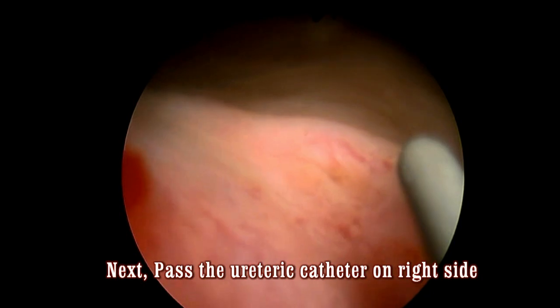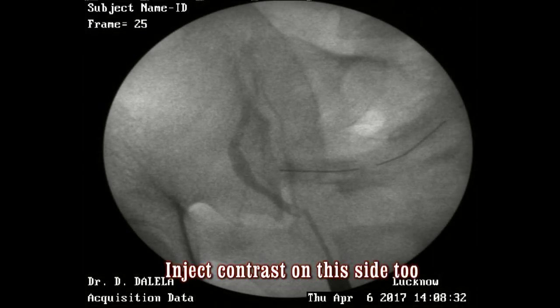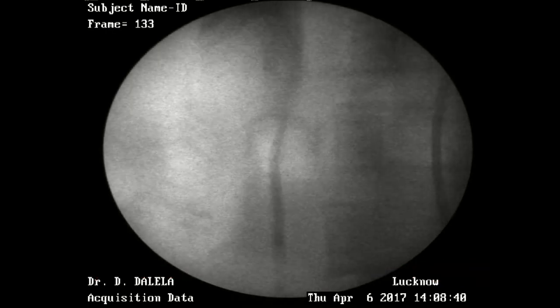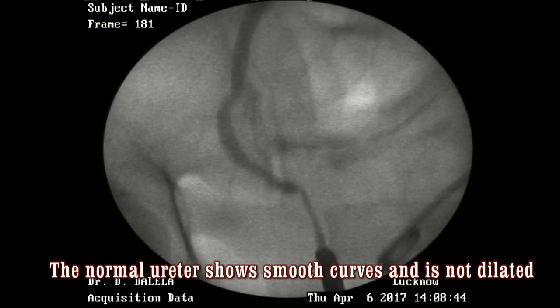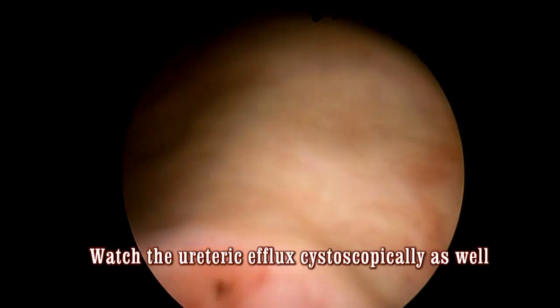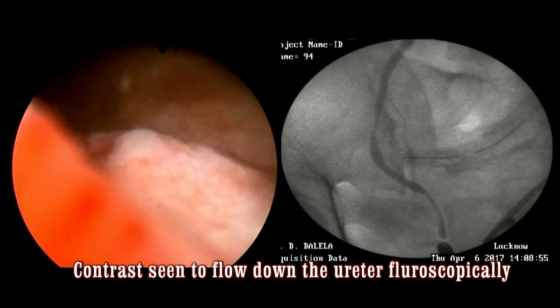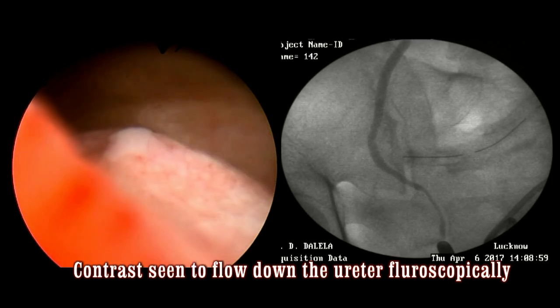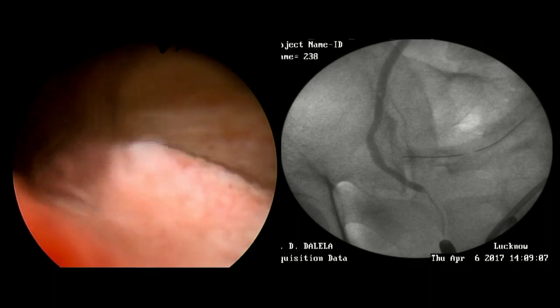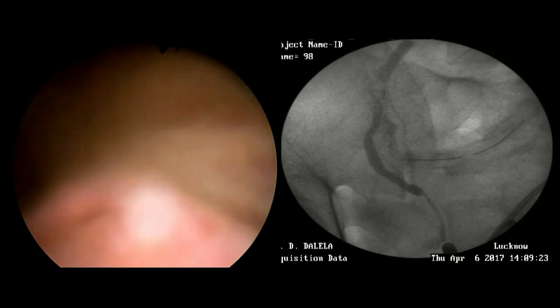Next, you pass the ureteric catheter on the right side and inject some contrast to obtain a fluoroscopic image of the ureter. You will see a ureter which is normal — this has to be demonstrated fluoroscopically. The normal ureter shows smooth curves and is not dilated. As you withdraw the ureteric catheter, the contrast filled in the ureter and renal pelvis will drain down. You can watch the ureteric jet cystoscopically and also watch ureteric peristalsis fluoroscopically. By observing these normal phenomena, you can be sure there is no fistula formation on this side. Even if you demonstrate a fistula in one ureter, you must demonstrate that the other ureter is normal and healthy.